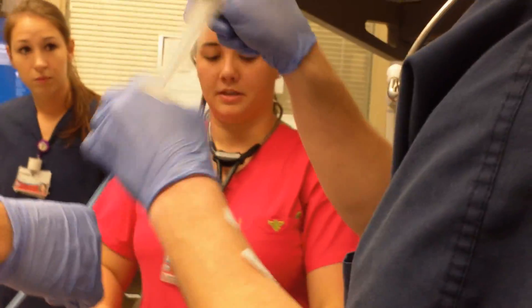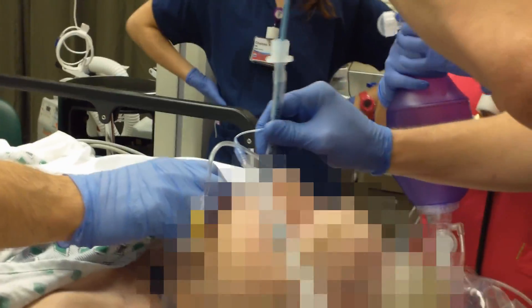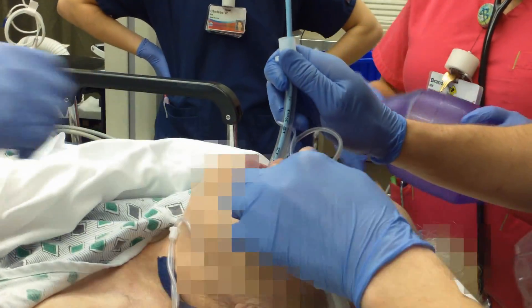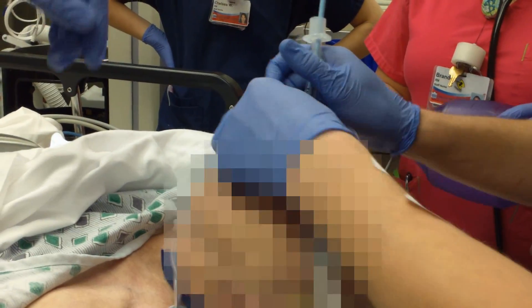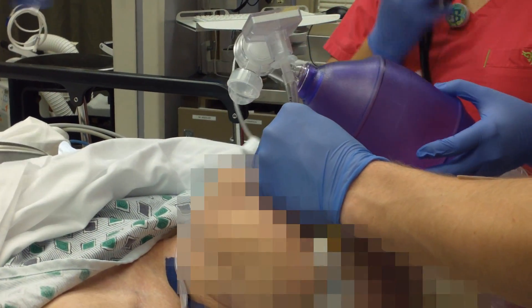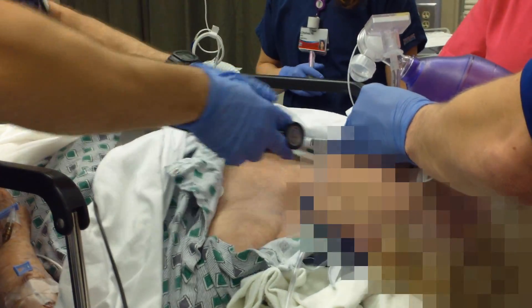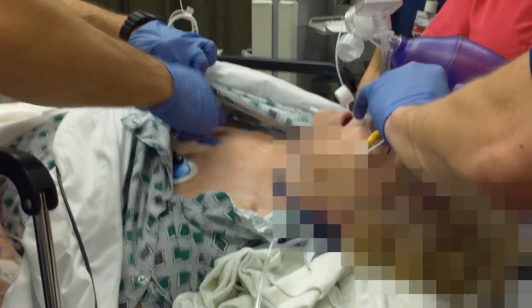You're good. Take the stylet out, please. Dr. Miller, will you turn the airway bag up a little for a minute? 23 at the teeth. Good color change, good color change, good chest rise, breath sounds bilaterally. Good job.